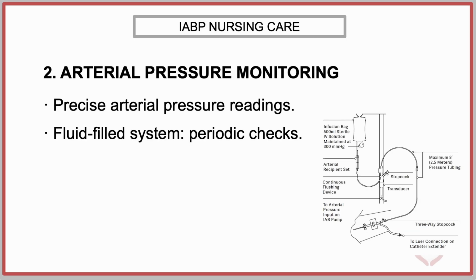If the pressure monitoring system uses a fluid-filled pressure line, periodic checks should be performed. Recommendations include frequent verification of transducer leveling, avoidance of unnecessary line disconnections, and prompt troubleshooting of waveform artifacts. Nursing staff should routinely assess the arterial waveform for signs of damping, including reduced amplitude, loss of dicrotic notch definition, or sluggish upstroke.